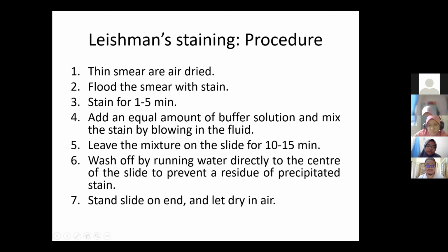Okay, once it is dry, and you know when it is nicely dry, you need to flood the smear with stain. Now we're going to use a pipette and flood. Yeah. So again, no need to be aggressive. Some people squirt the stain with a very fast flow sampai terkoyak smear tu balik. We don't want that.